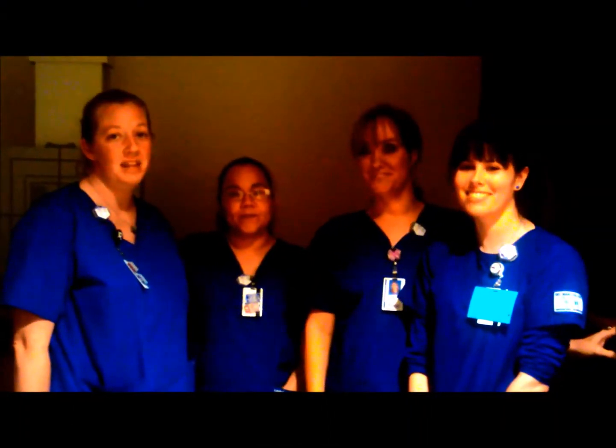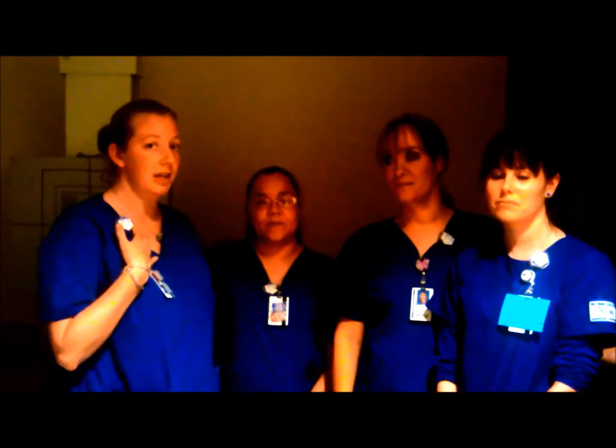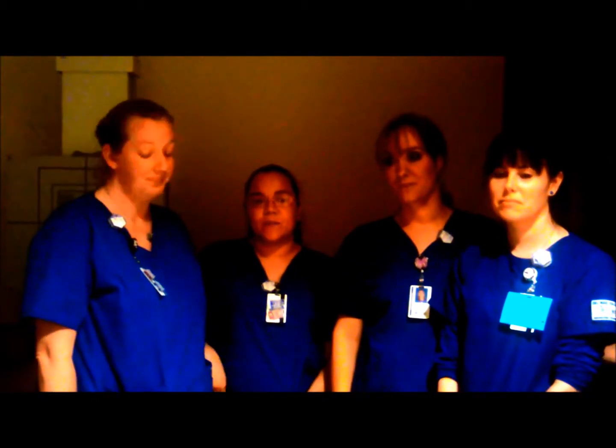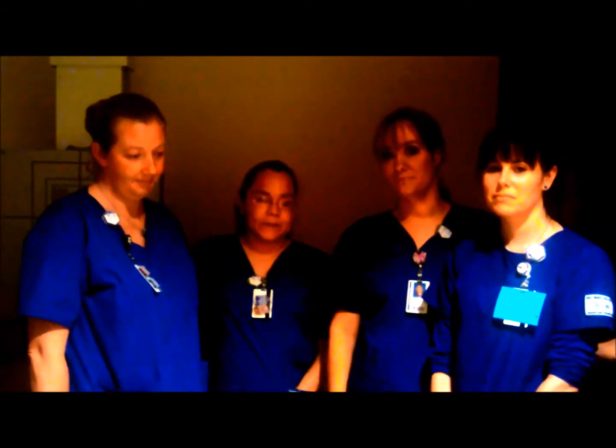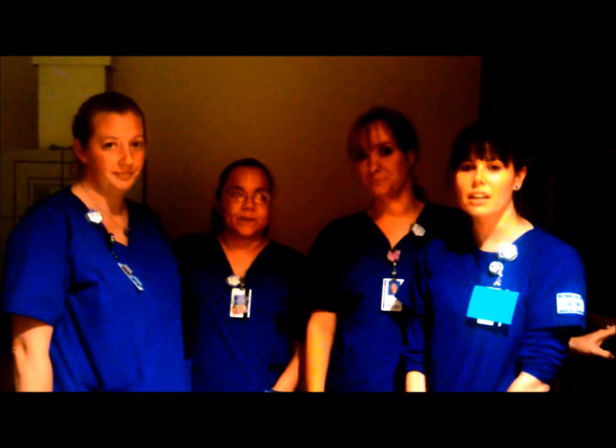I am Jamie, Amanda, Nicole, and we're going to be demonstrating the lumbar spine. I will demonstrate the AP projection. I will be demonstrating the obliques. I will be demonstrating the lateral lumbar spine. And I will demonstrate the L5S1.